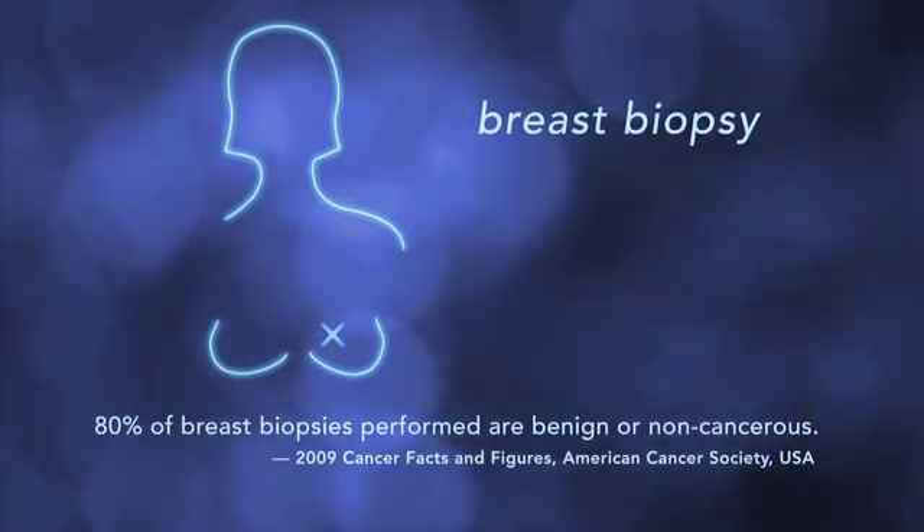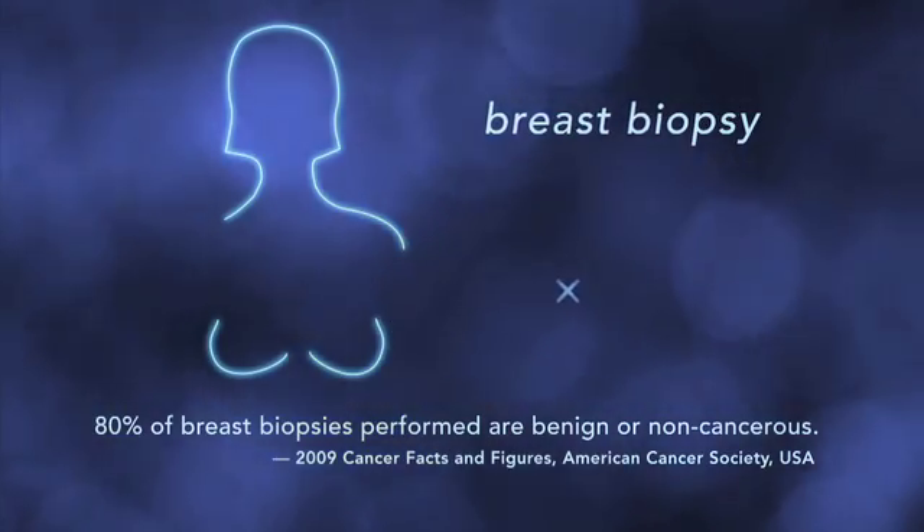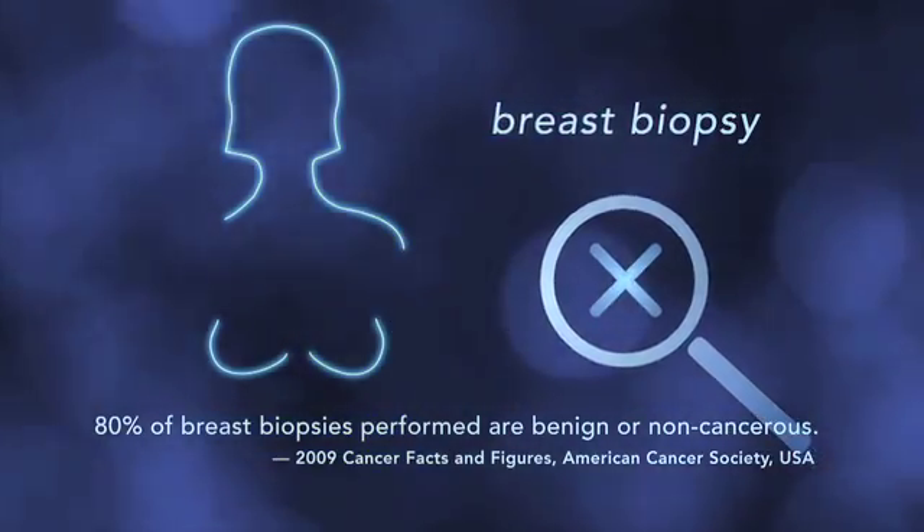We all know the best defense against breast cancer is early detection. Your radiologist might see something in your breast exam that looks suspicious. To find out more, we perform a breast biopsy. That means we take a sample of breast tissue which is then studied in a pathology lab.